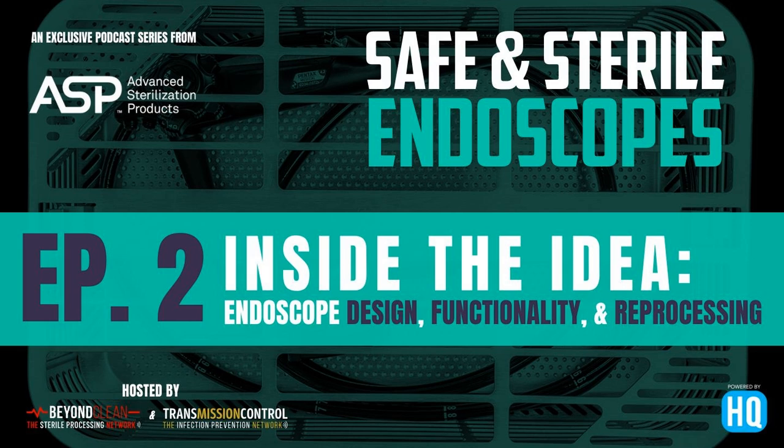So endoscope MDMs are finding alternatives, finding different grades of materials, different grades of lubricants and adhesives to use. So it's not uncommon for them to send us prototypes with different adhesives, different lubricants, and different materials to test out. If it does well, then they can proceed with that. If not, they'll just have to find an alternative.